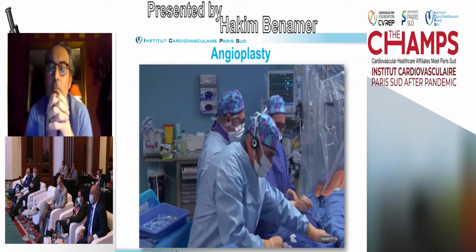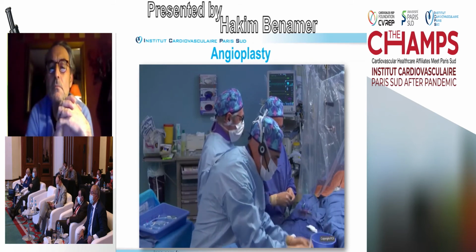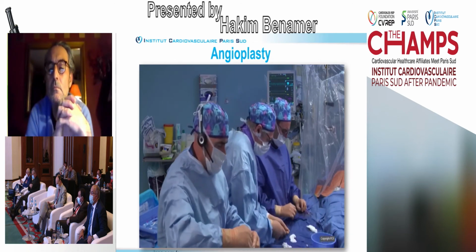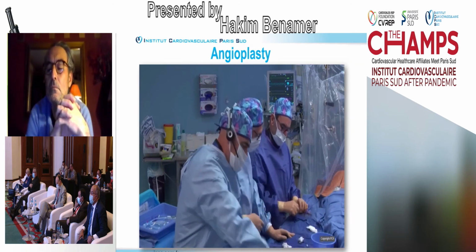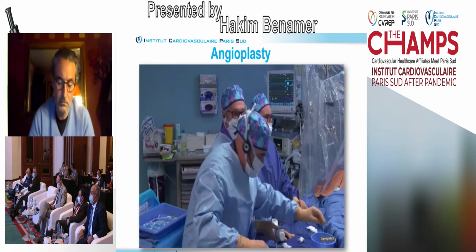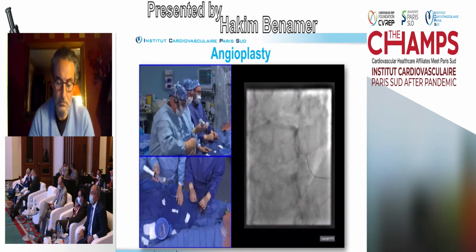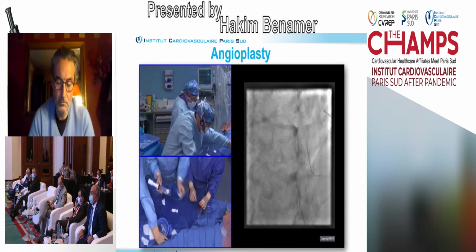I think it is really nice. You have to know how to use this. You need to do post-dilation with this device, otherwise you might have problems. I think it's a nice device to have, even more in tapered situations, because this situation we can still handle with a conventional stent. In a more difficult situation where you have to do PCI, for this particular case I wouldn't take it. I think for this one we stay with the conventional stent.